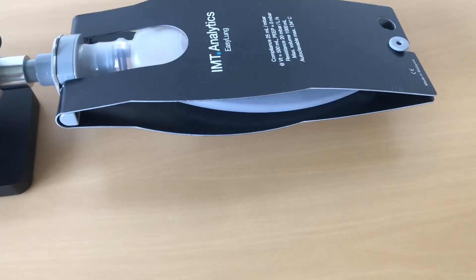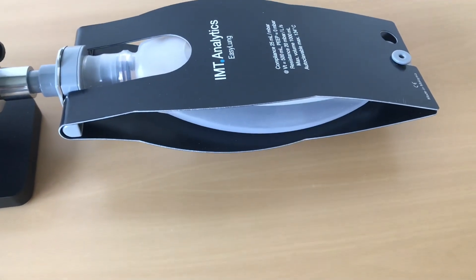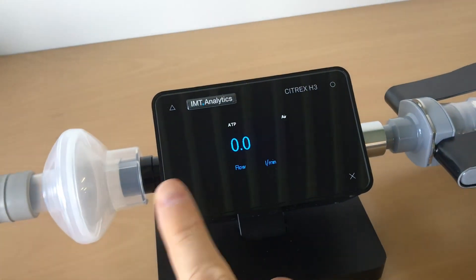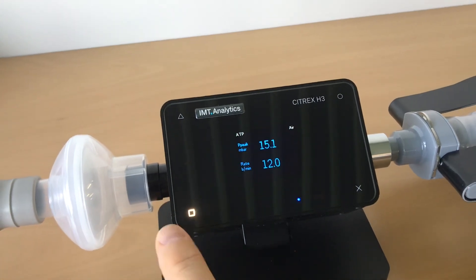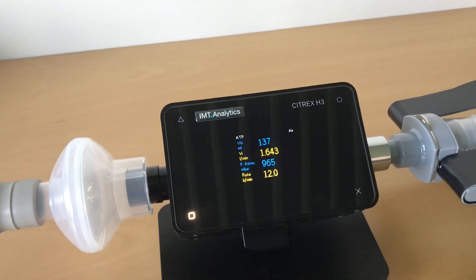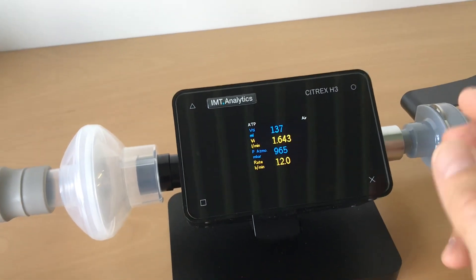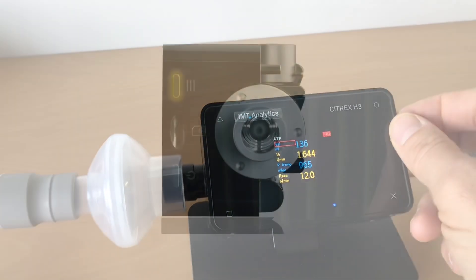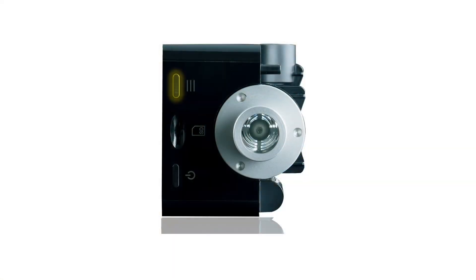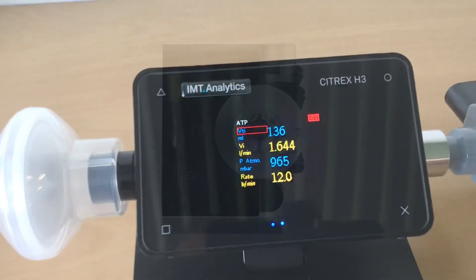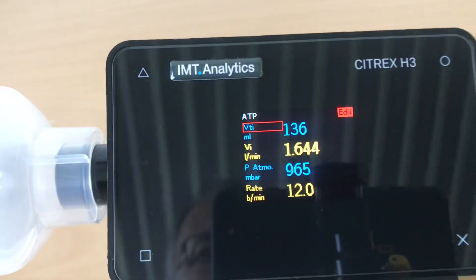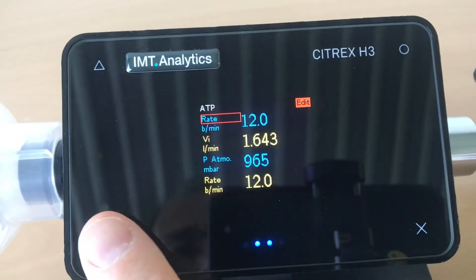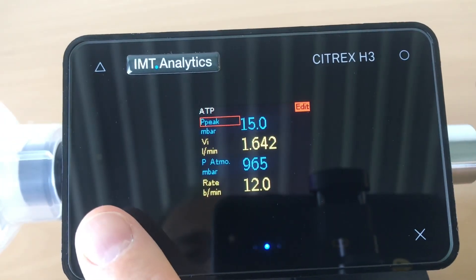To compare the parameters on the ventilator with the measurements on the Citrex, it's very helpful that you configure the screen on the Citrex device in the exact way. So you double-click this button on the top right corner and now you can configure the parameters you want to check.